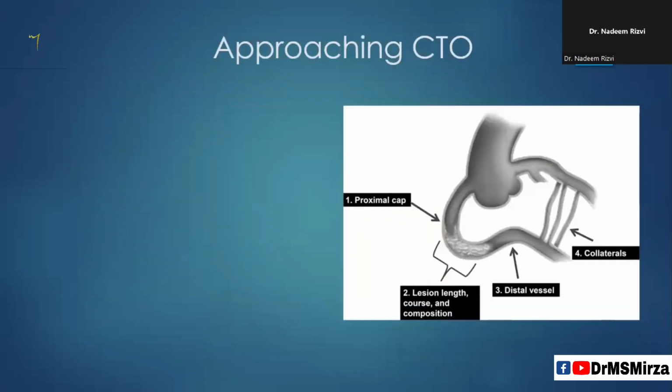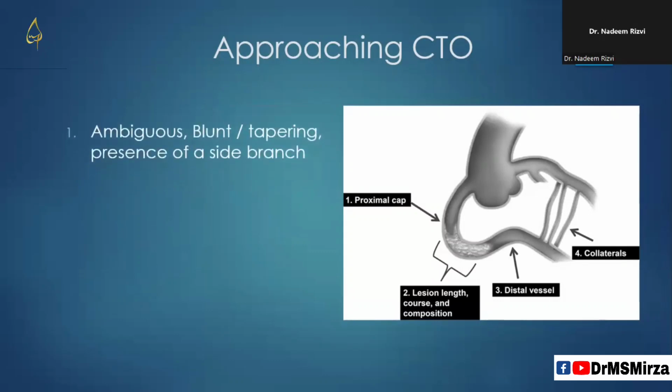Extra support is needed. Sherpa NX balance is a better option. Now, some words on approaching a CTO, we have to go through the 4 parameters. The first one is the proximal cap. We have to look for whether it is ambiguous or not. If it is not, then we have to look for whether the proximal cap is blunt or tapering, and whether there is any presence of a side branch near the proximal cap.